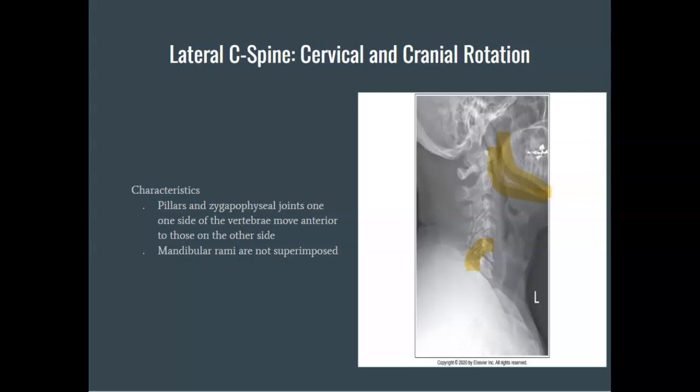It is very difficult to determine which side of the patient is rotated towards or away because of the cervical vertebra being so identical on each side. The best suggestion is to go back out to the patient and ensure that the mid-coronal plane is perpendicular with the IR.